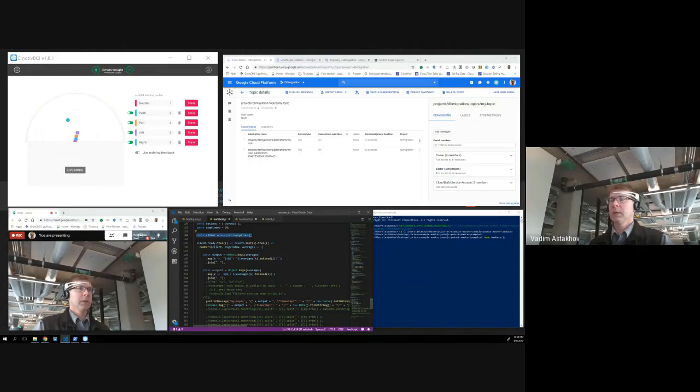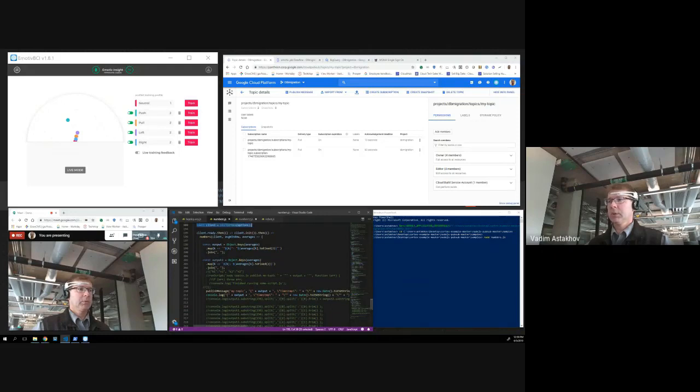So what I did, I created a Node.js script, which is using a BCI library called Cortex. In this library, I intercept the data from the device. It's very simple code. And then I publish that data. I have a function to publish to my topic. So basically, I use the Node.js API to push that data.